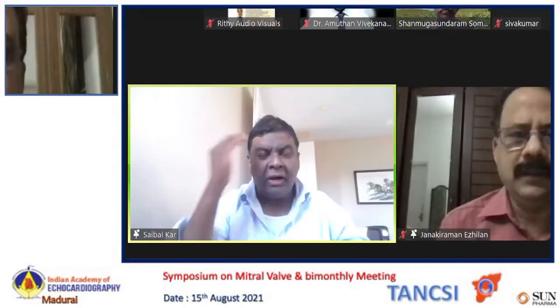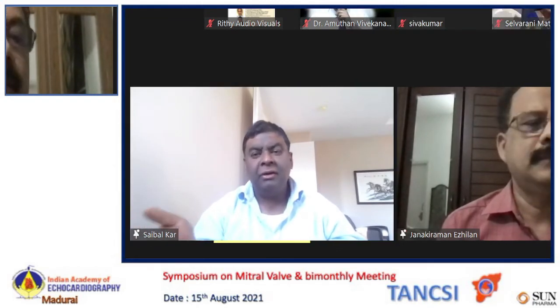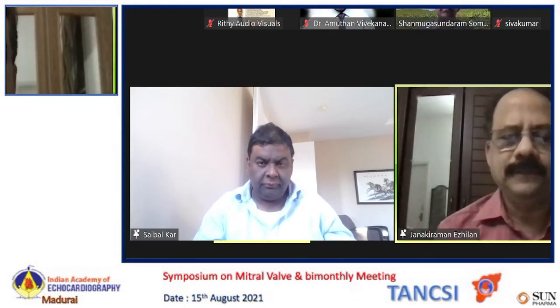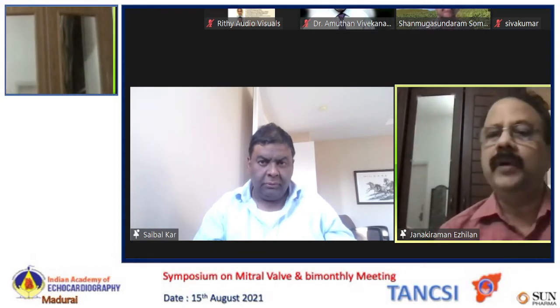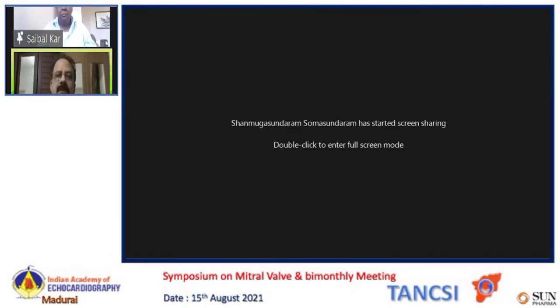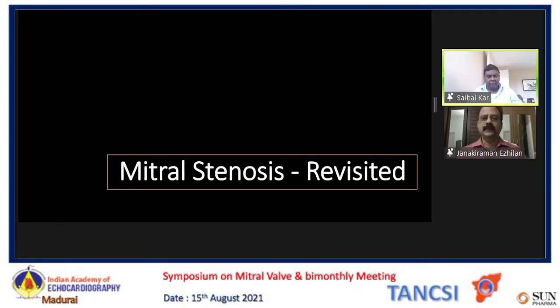So you understand why, this is why I was telling you on the French trial, since you brought it up, that they started with less severe degrees of MR, so they never showed the benefit. Thank you, sir. So you have shown that it is not only important to choose the right patient, but also the degree of MR reduction is very important following the procedure. That's right. And you don't have to abolish MR. Even if you bring it to about 2 plus or less, it's okay.